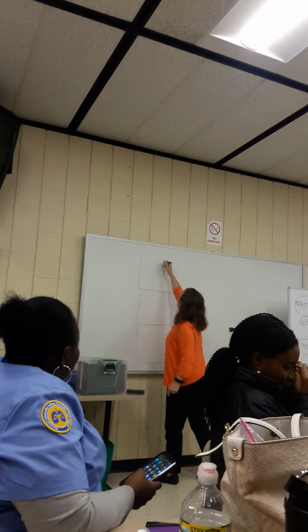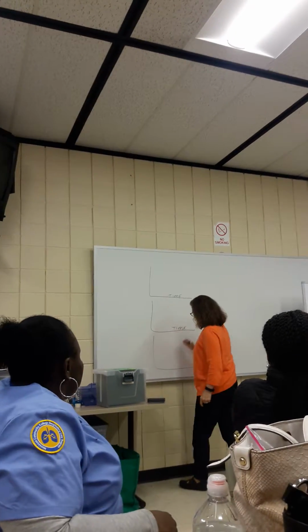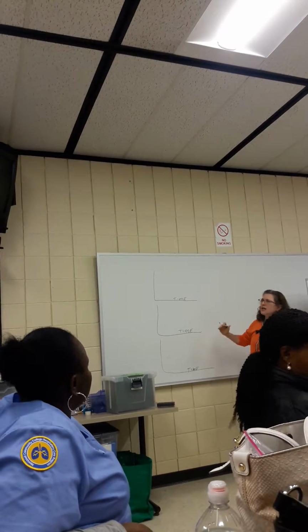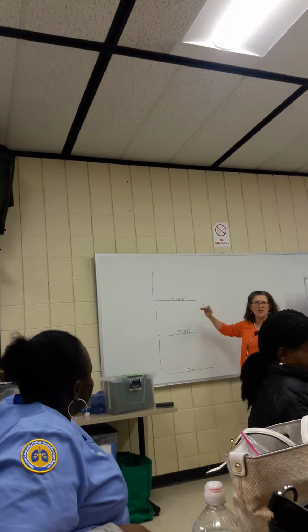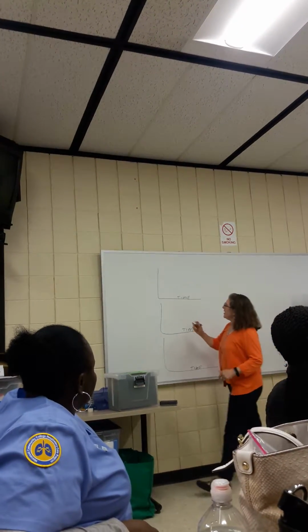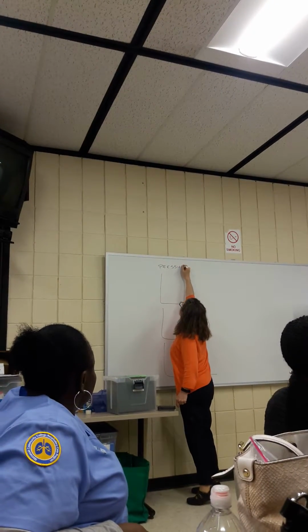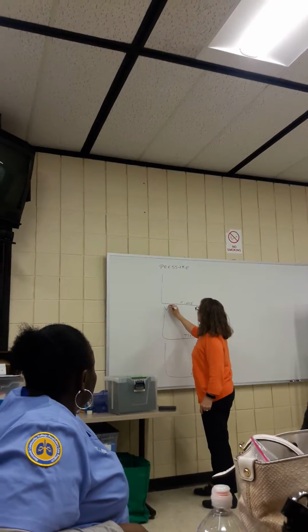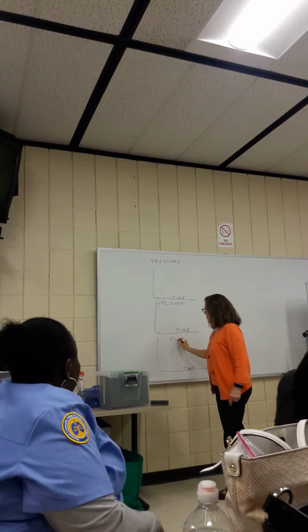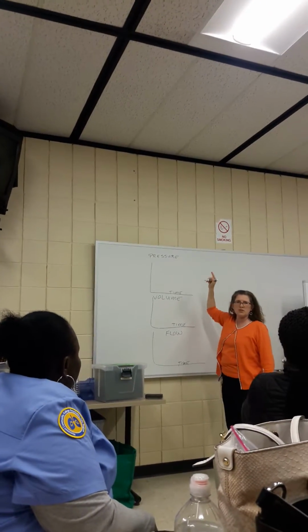So all of this is going to be time on your x-axis, okay? Just note that my breaths are not going to match necessarily, because my freehand drawing is not good. So we can have a pressure scalar, a volume scalar, and then a flow. Flow versus time, volume versus time, pressure versus time.